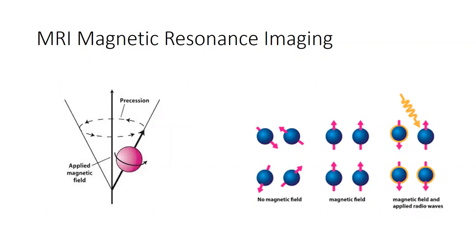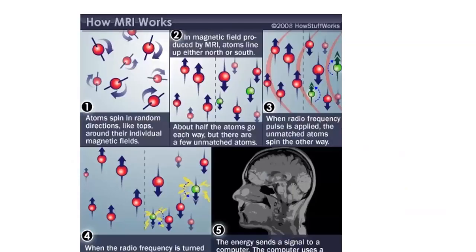Everybody can really groan now from organic chemistry. Remember NMR? Well, it's a visual representation of NMR, okay, in real time. And it's not one pure chemical. It's actually looking at all these nuclei together. And when you take that information and align it, you can get a map like this, all right?